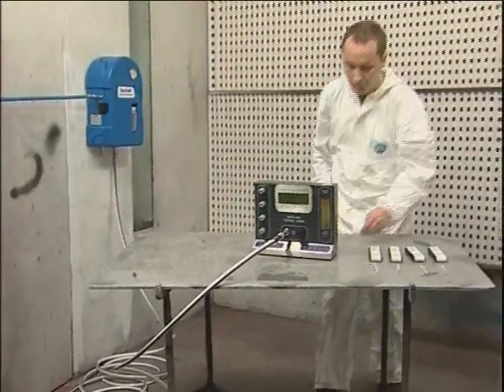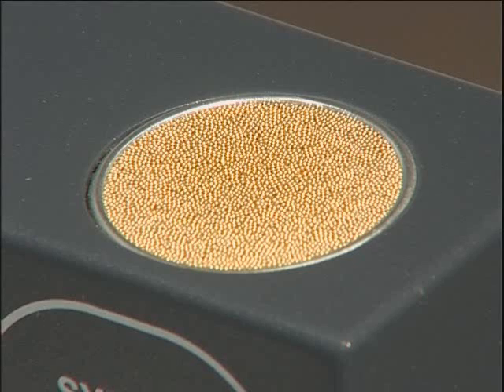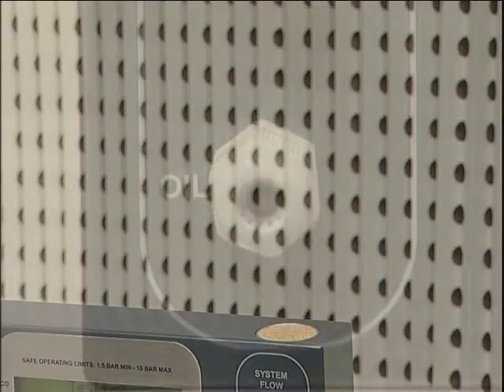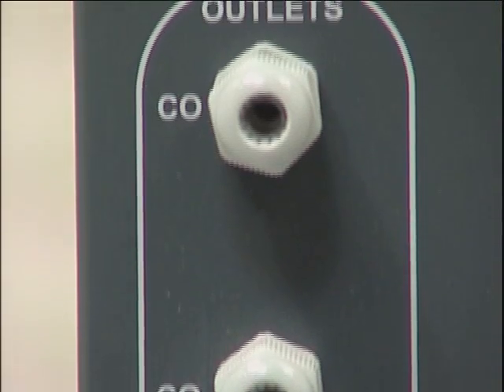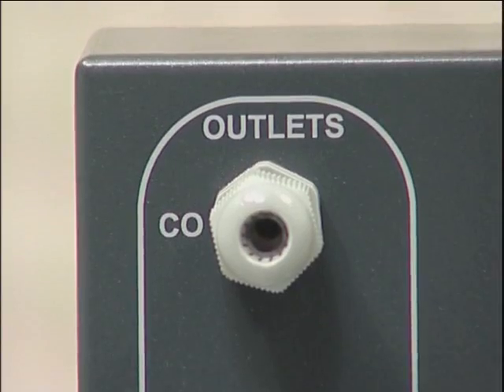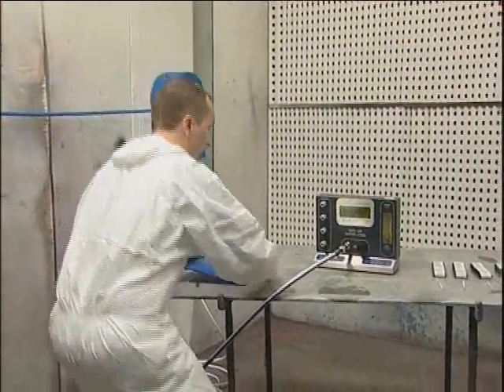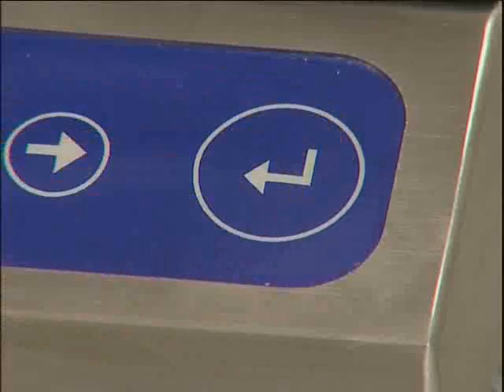Carry out the odour test by smelling the air exhausted from the sintered bronze outlet above the flow meter. If there is a serious odour problem, fail the sample at this point of the test. Initiating flows of seriously contaminated air through the tube ports could result in damage to the unit.